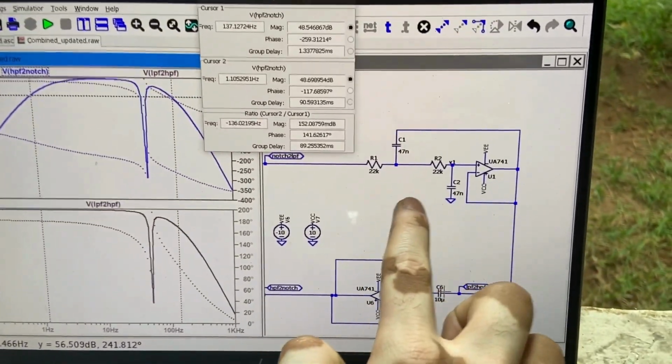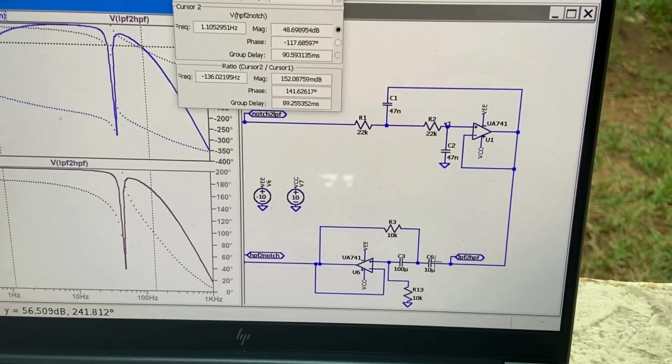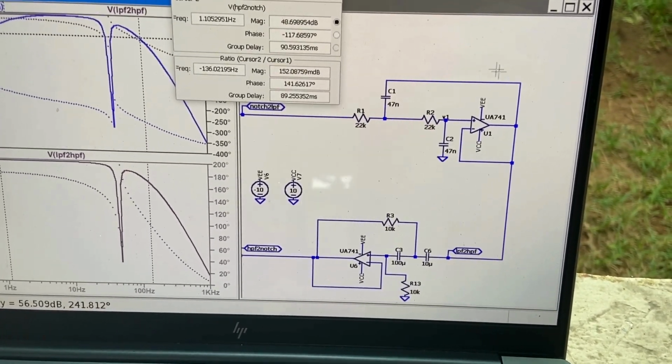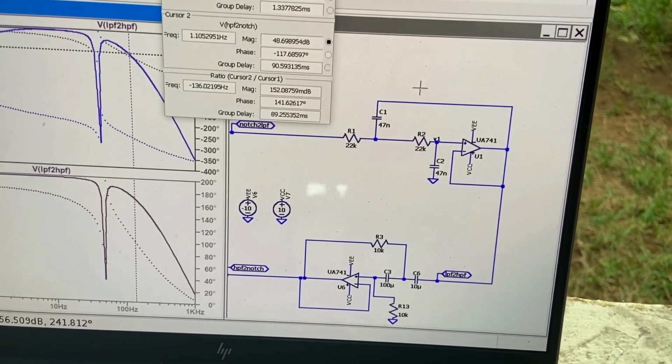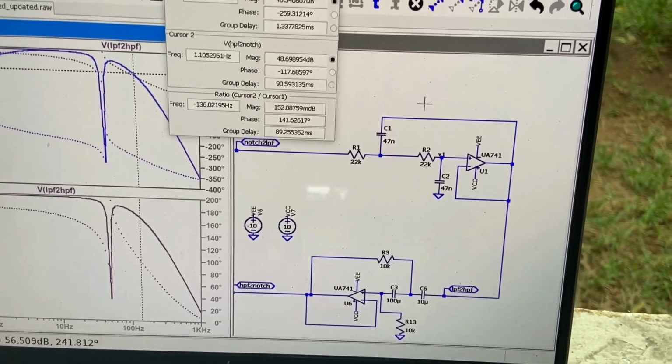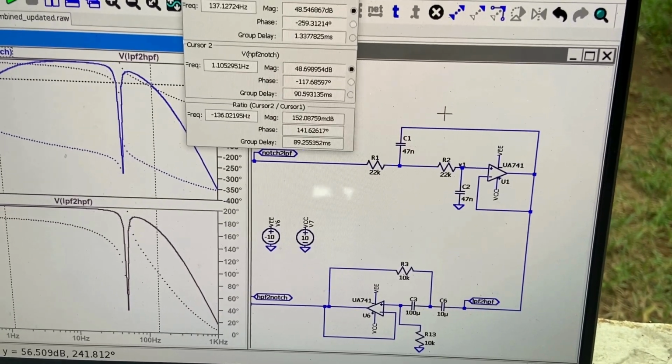So here we have the active second order low pass filter followed by the active second order high pass filter. What is the reason for using these circuits? Because we have to specify a particular bandwidth within which we're supposed to perform the ECG analysis, and we're supposed to negate all the other noises which come before the 0.5 Hz and after the 150 Hz which we are ideally trying to achieve.